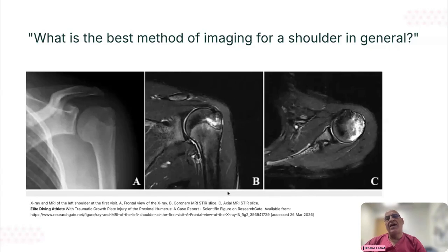And you've got these bright areas. Can you see the bright areas in there? So that's basically a stress response, a stress fracture. They've not fused their epiphyses. Quite a young patient, I think. So they've got a traumatic growth plate injury there. So this patient would need rest, otherwise they're not going to do too well. They bang the growth plate like this while they dive down.